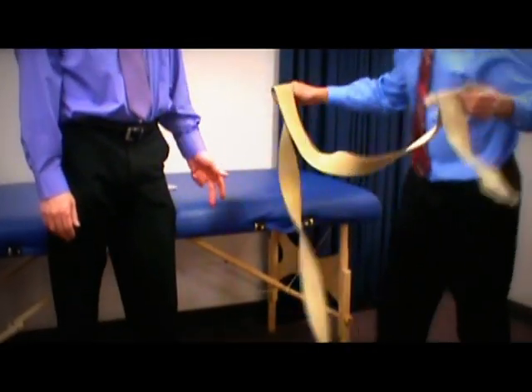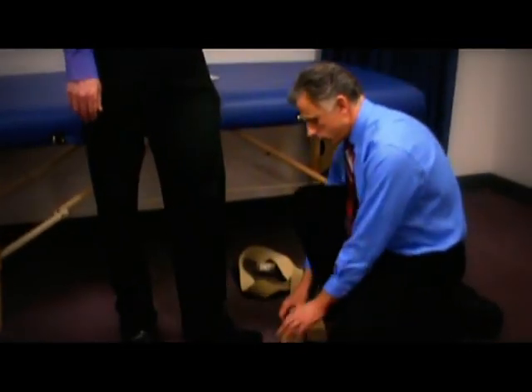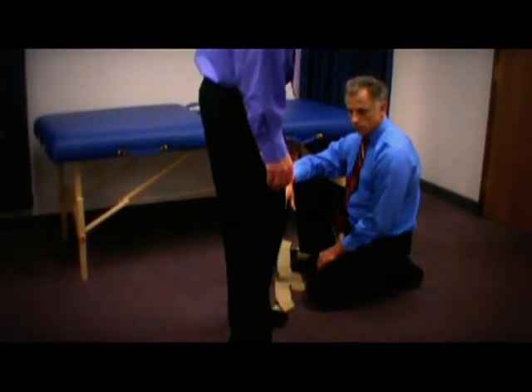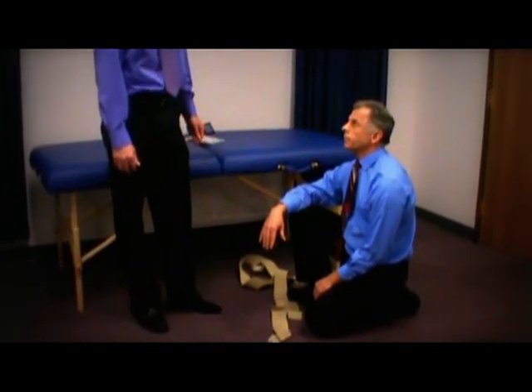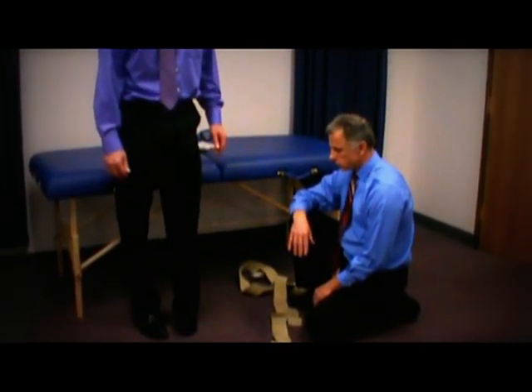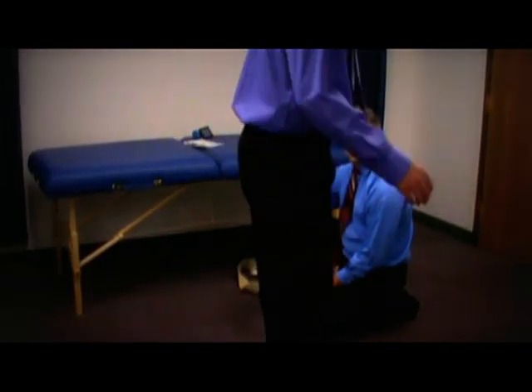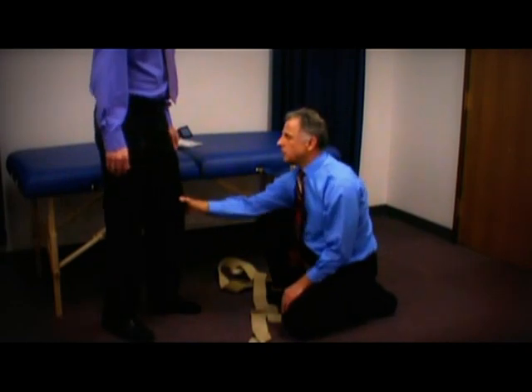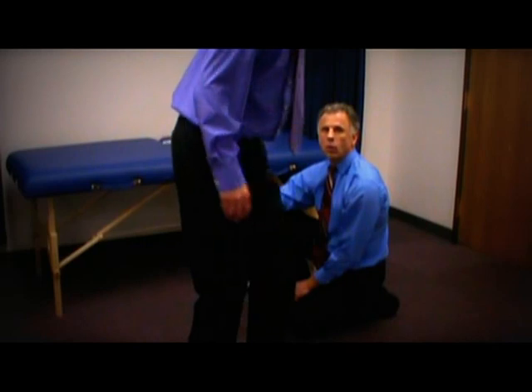And what we have is a lot of patients, especially if you have increased tone, the leg is going to turn out like this, and they're going to walk like this. They may also even have some weakness, of course, throughout the leg. The whole thing is they have trouble bringing the leg back in like this. They're walking, and they even may do this type of thing. Or I find that if the quad's a little weak and that knee wants to buckle a little bit, this will help stabilize that quad as well.